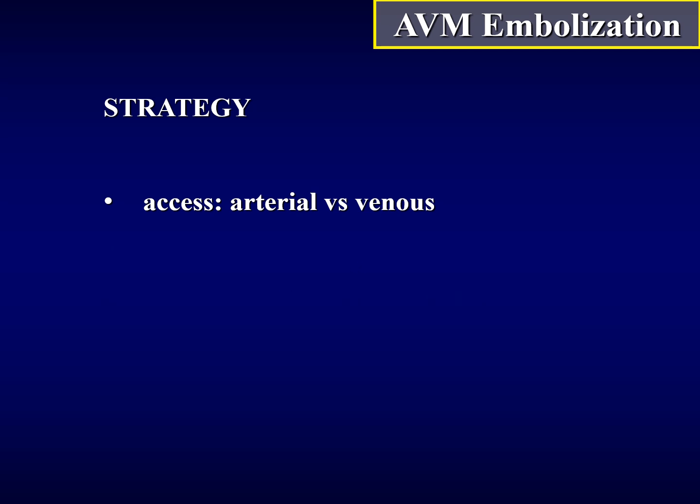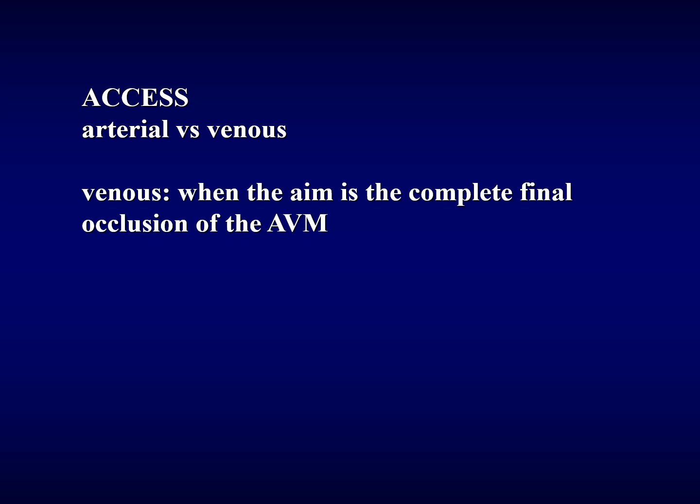About arterial versus venous, usually today the venous approach is considered the number one approach to have a complete occlusion of the AVM and a complete cure of the AVM through the endovascular approach.